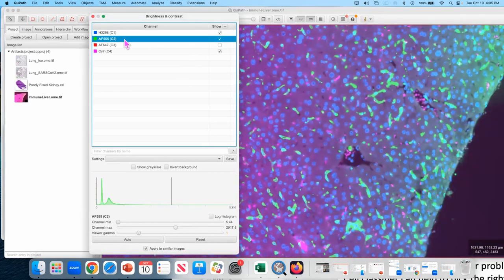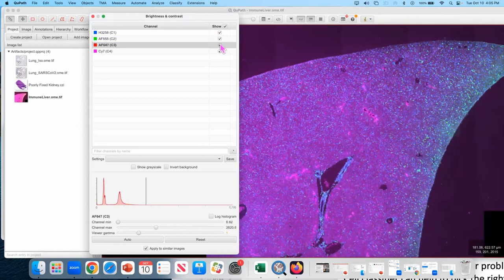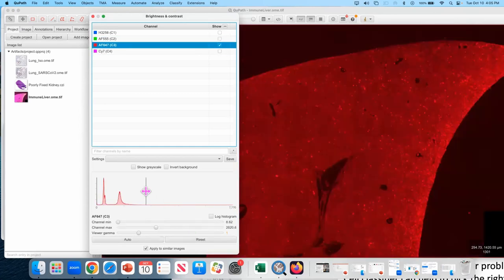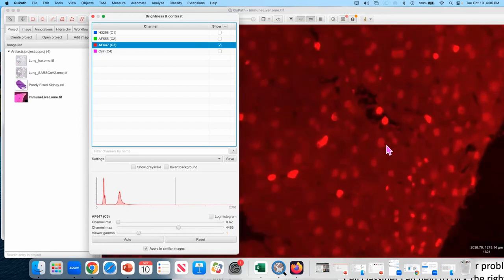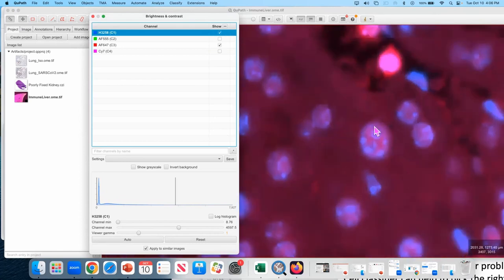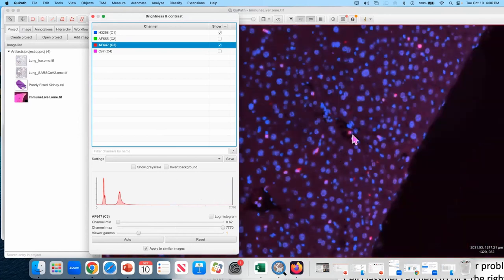Then we have some IBA1 staining in the green, and you see that the border of the tissue is a lot brighter than the rest. And then finally we have staining for Ly6G. This is supposed to be a neutrophil marker. And in this particular tissue section, we see that there are a bunch of nuclei that are large. Those nuclei belong to hepatocytes. You can see it by the pattern. They are not neutrophils at all. And that's a neutrophil, and that's a neutrophil, and that's a neutrophil.